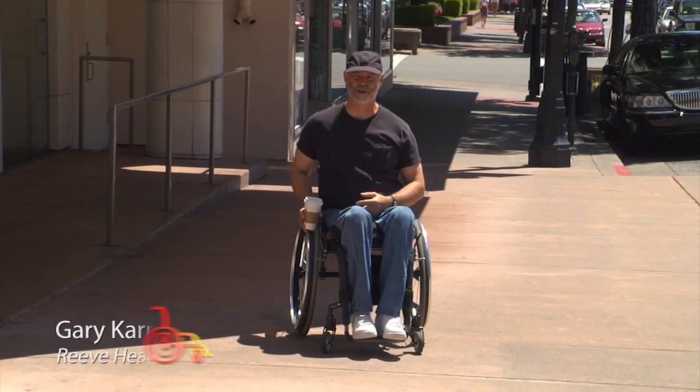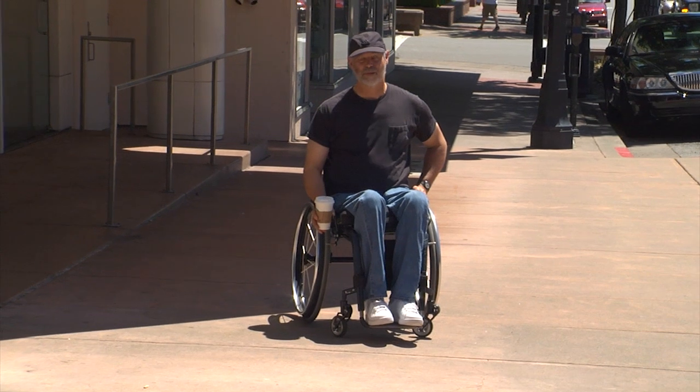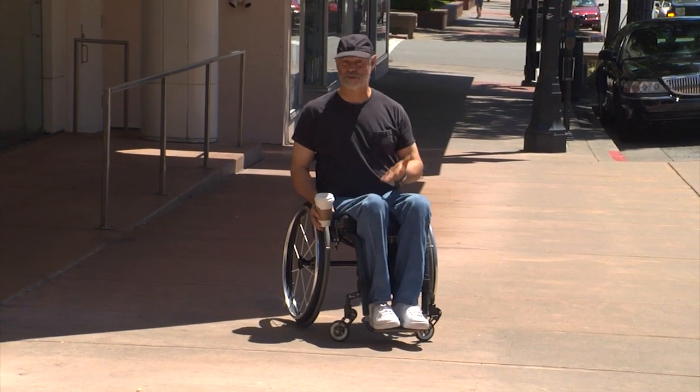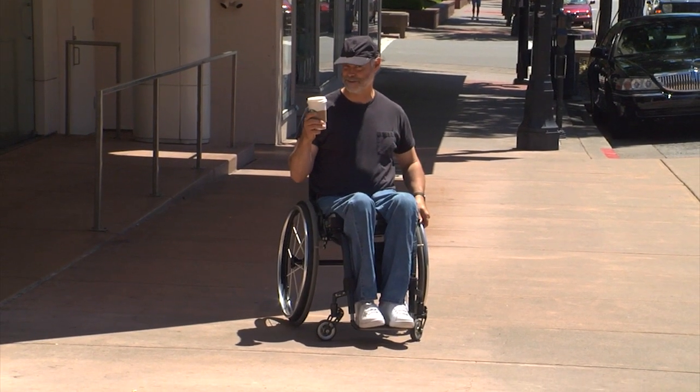Hi, I'm Gary Karp with this Reeve Health Minute. Usually you want to use both hands when you're pushing your wheelchair, but in the real world sometimes you've only got one hand free — like if you're balancing a bag of groceries in your lap, or when you have a nice hot vanilla latte like this one here.